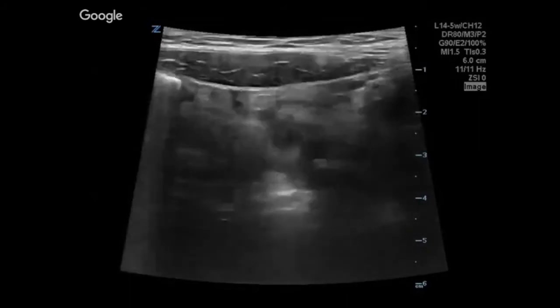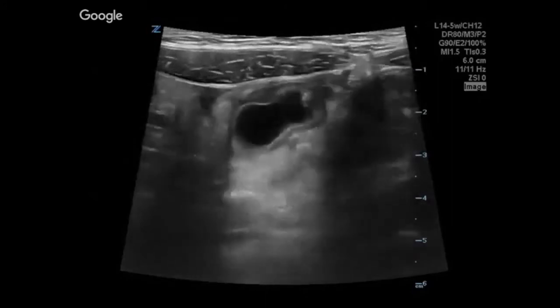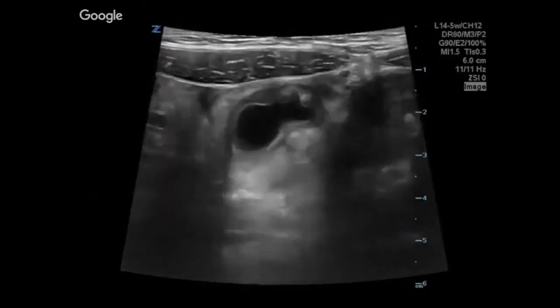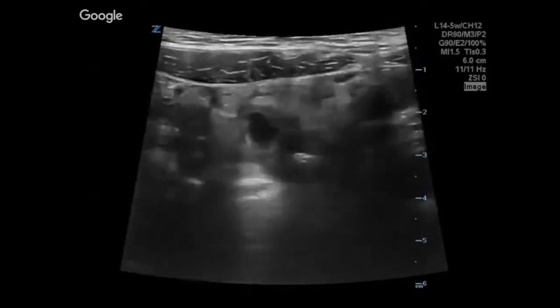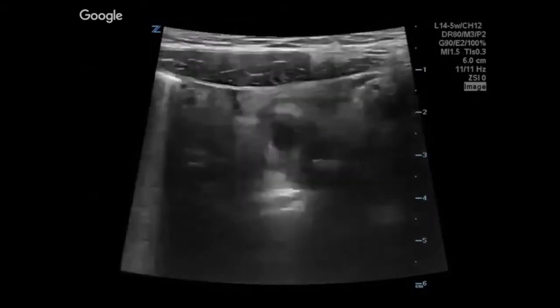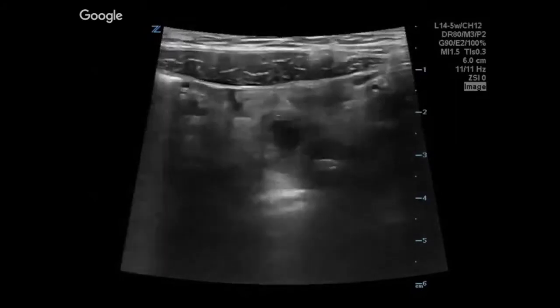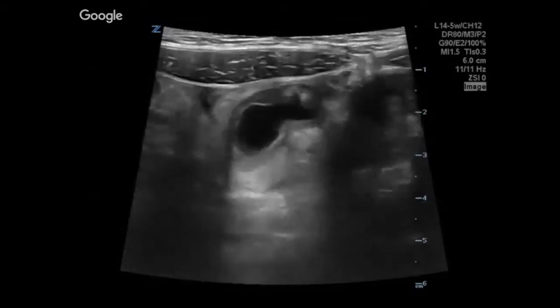First of all, the story of this kid is interesting because he came with acute abdomen, so he went to do a comprehensive ultrasound, and we went to scan him, so he was already after. We put the probe, and of course we were with Mark. I said, what's that? Stop on that. I think this is the second time, here it looks more inflamed around. And then you would just focus on that, and it looks like thickened wall, a cyst, encapsulated.